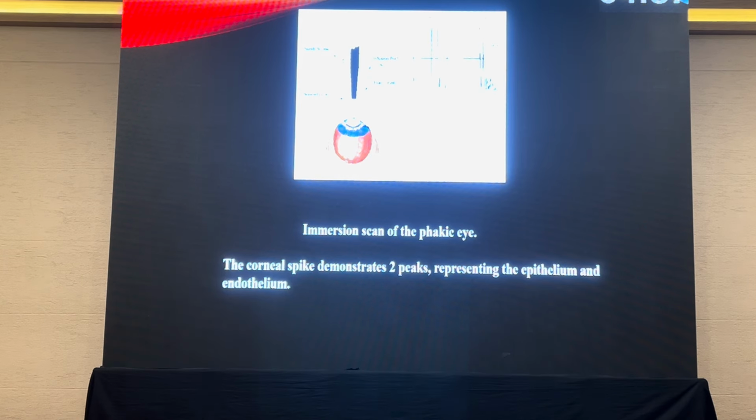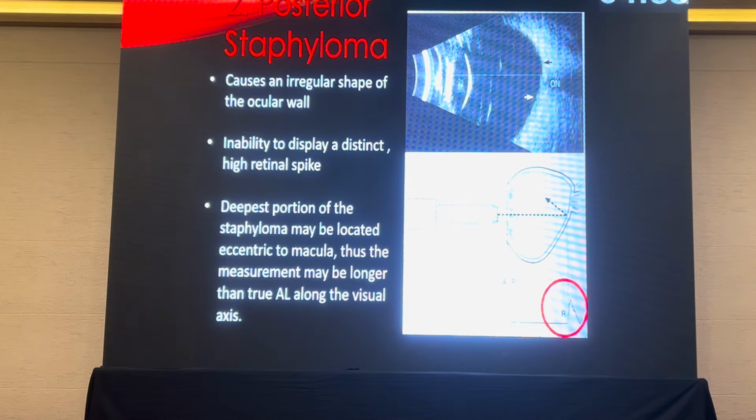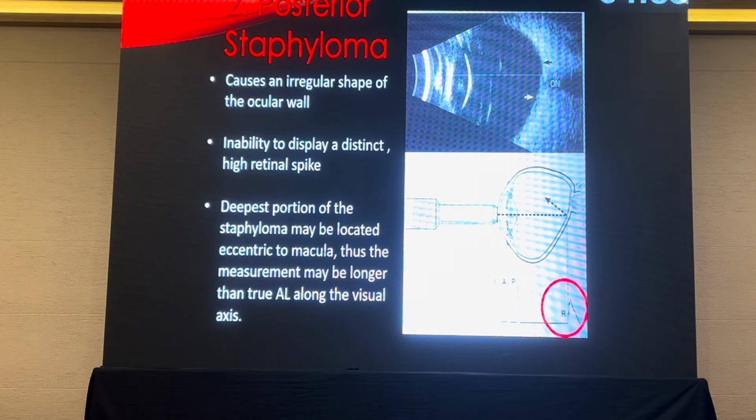There is a distance. And in special cases, for example a posterior staphyloma, the probe may be off the macula, so you may get a falsely larger length if it is off the macula.